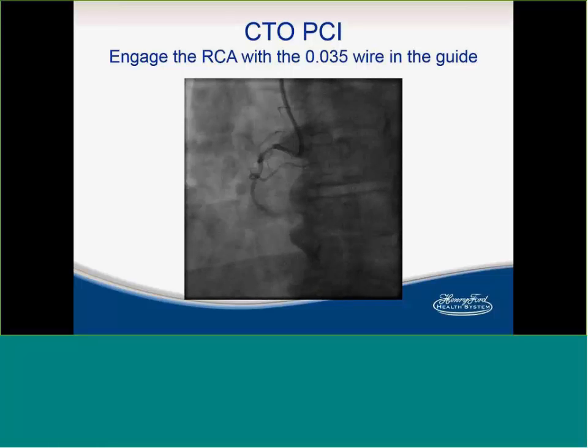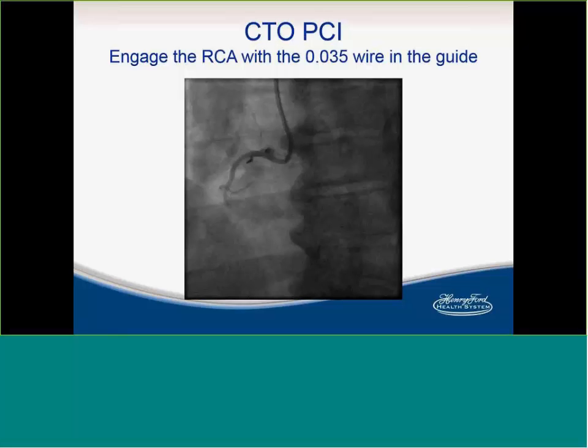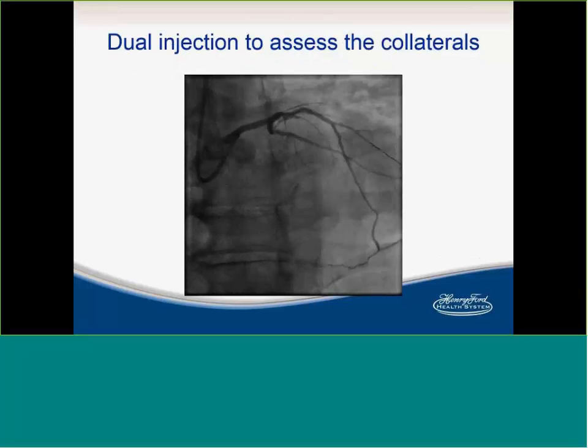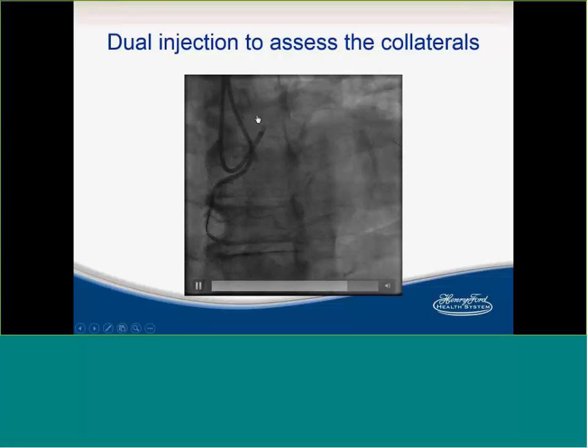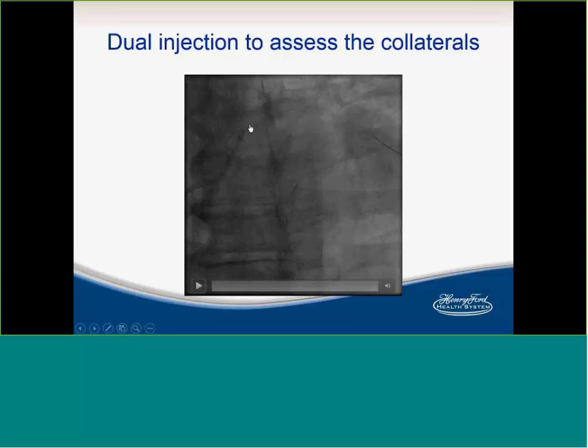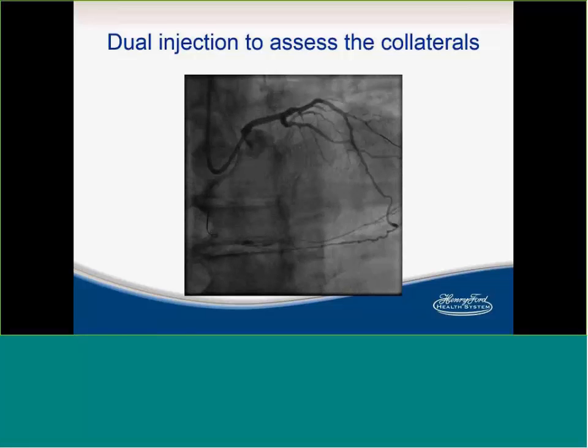So back to our patient. As you can tell, there is actually an occluded stent in here, and there is probably a stent in here approximately. So this is basically good if you can get in the mouth of the stent, but you can't really make a decision on a strategy until you do dual injection and you see your occlusion segment from both ends. And I normally put a wire in my left main just to stabilize the guide, and I think the wire protects the left main from the guide digging in and injuring the left main.